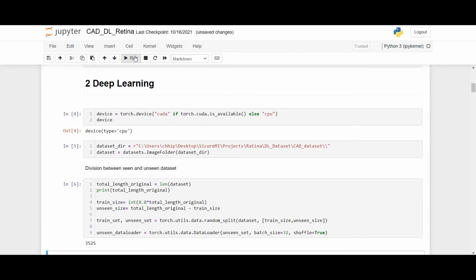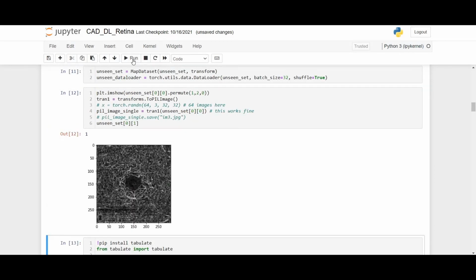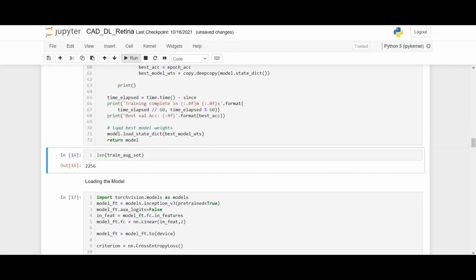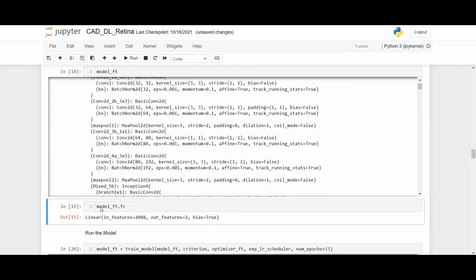First, we will import all the libraries, and then we will initialize the data augmentation process and do the image processing. After that we will create our deep learning model. For model creation we have used Inception v3 architecture. The model training process will take about 1.30 hours to complete.